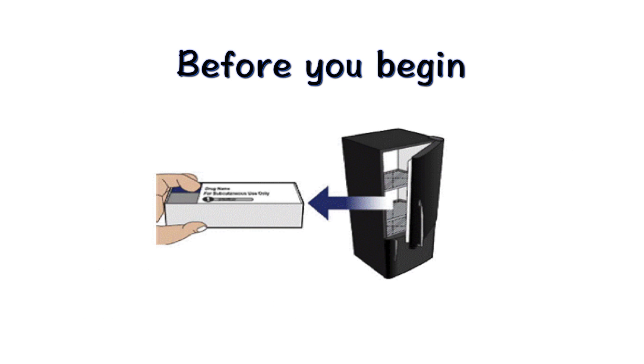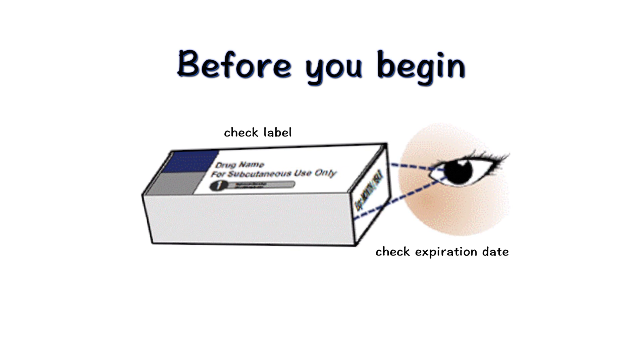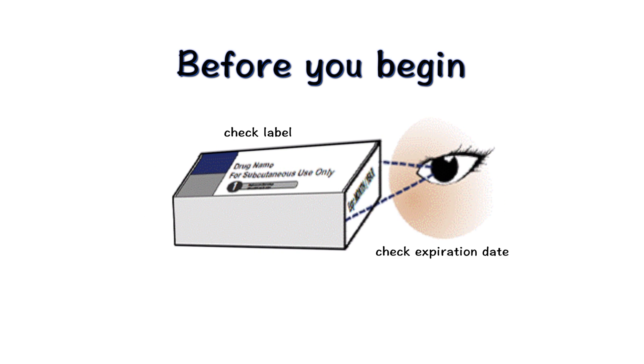Take the carton with syringes out of the refrigerator. It is important to dispose of any syringes that have been at room temperature for more than 24 hours. Next, check the label and the expiration date at the side of the carton.